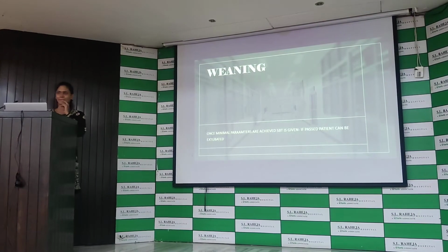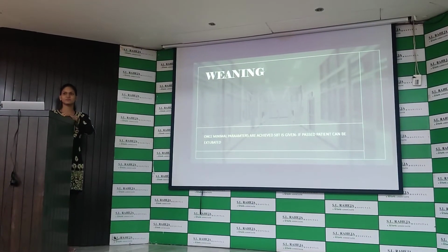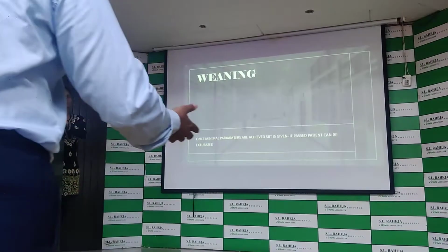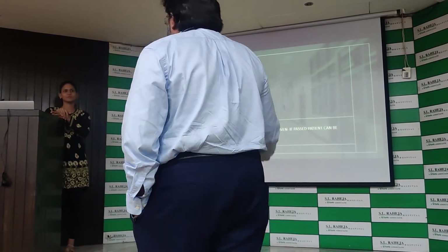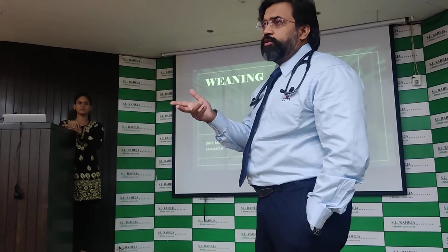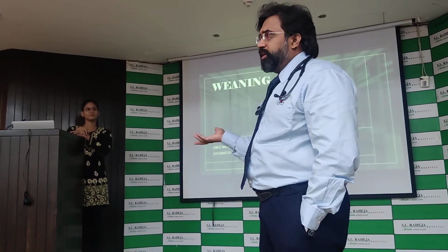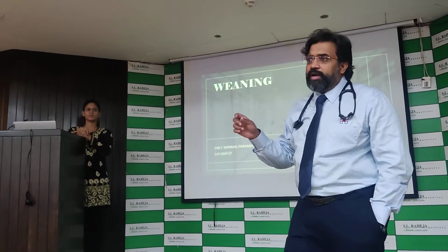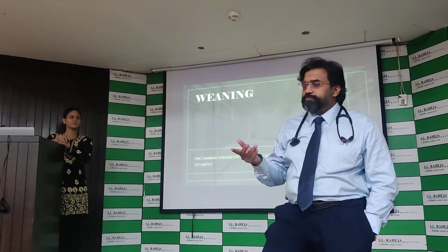So take the journey of a patient, for example. You come from an operation theatre or from the casualty. You set the minute ventilation as 130%. Now you started at that, and then you forget. All you have to do is adjust the oxygenation. Everything else it takes care of. So PEEP and FiO2 is all that you set.